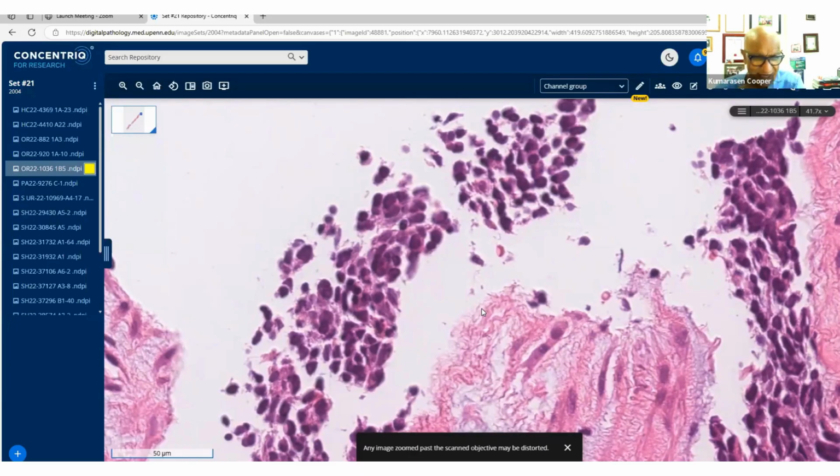And like I said, both keratin and desmin were positive. The dot-like desmin is extremely useful and helpful, very helpful. Last year, I think maybe in April, and if anybody from Durban, South Africa is here, they will remember that case. They showed me a case, maybe in October as well, I cannot remember now. A young man who had a disseminated small round blue cell tumor, and the mass that they biopsied was in the shoulder. And this is the pattern that it had.